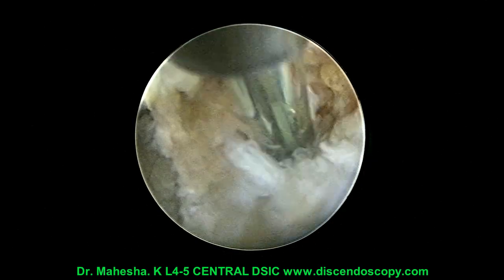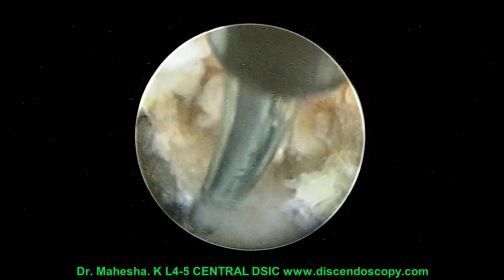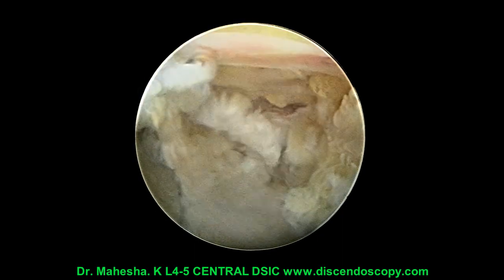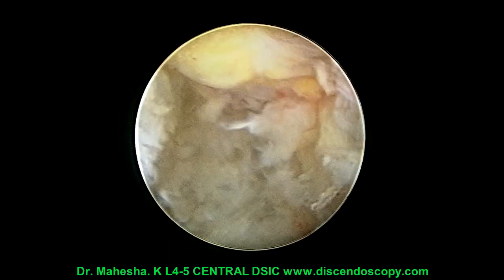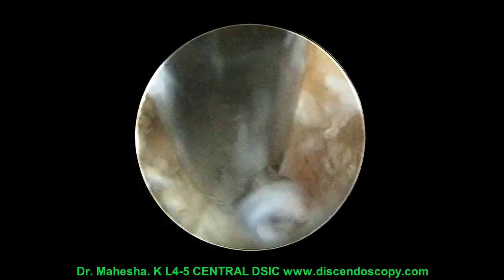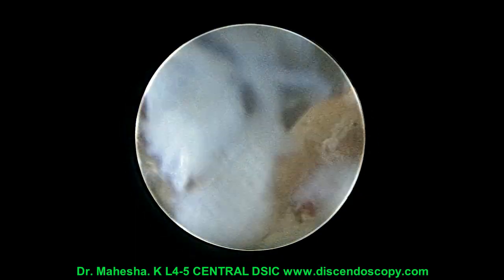This makes the surgical field much clearer, and you can see the epidural tissue at the top. A small grasper is used to clear the residual disc, and finally annuloplasty is done using RF.